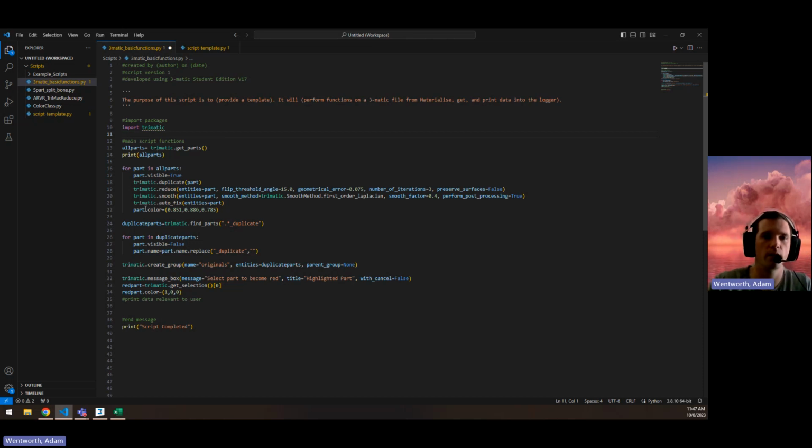That's a good practice to have when you're first starting with scripting, and as you're developing a script, to duplicate the original parts and keep them separate. Then when the script fails and you're just running it over and over again, you can just get rid of the parts that were used in the functions, and you can still retain your original batch of parts. That could be useful for any workflow. Then at the bottom here, we're just demonstrating that you could have things like get selection as a function, which will enable a user to pick a part to have certain functions applied to that part.